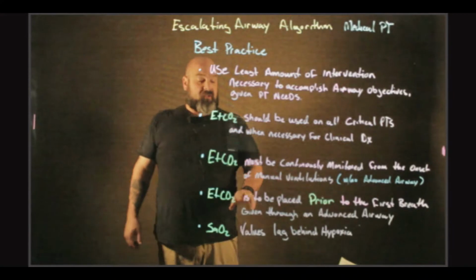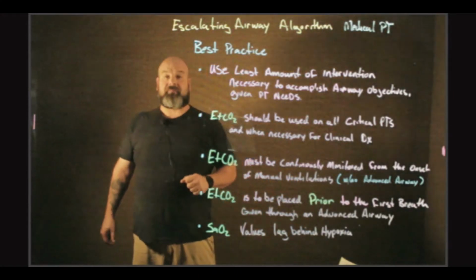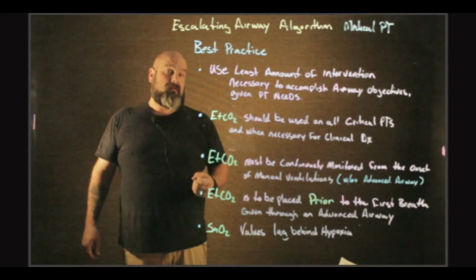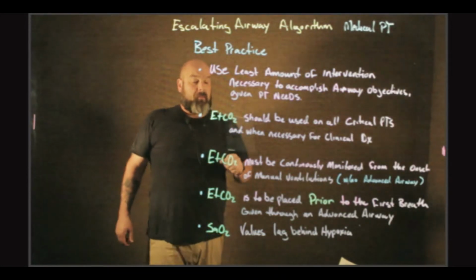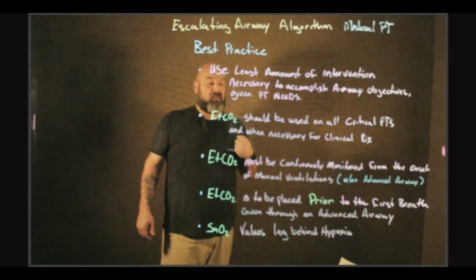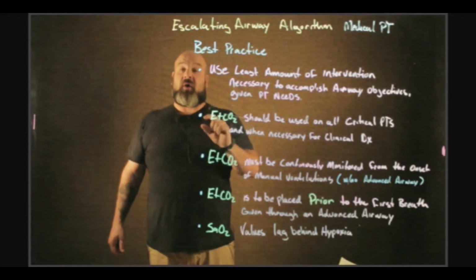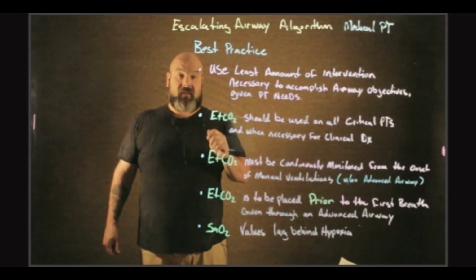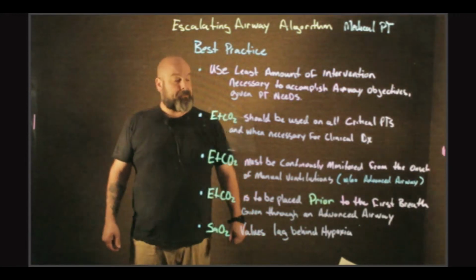End-tidal CO2 is to be placed prior to the first breath with an advanced airway. Advanced airway being an LMA, an ET tube, that sort of thing. So it is to be placed prior to the first breath given through an advanced airway. Well, if we're following our best practice, we already have it attached to the bag mask. So it's already in place and you've got a good indicator of your ventilatory status.